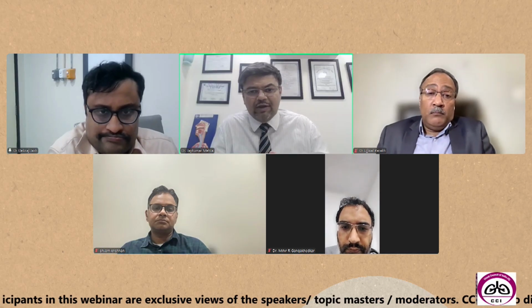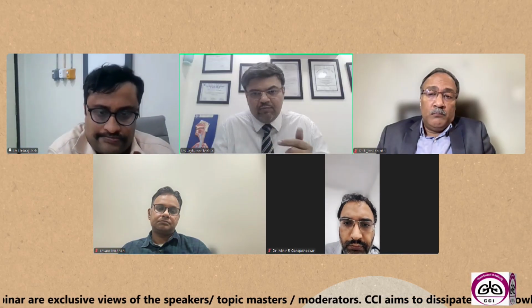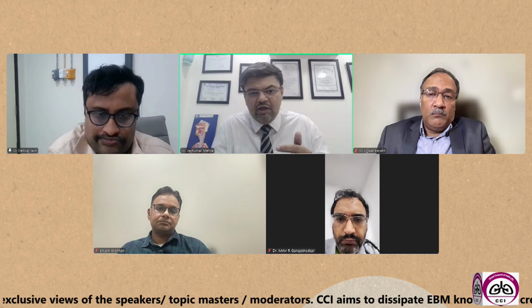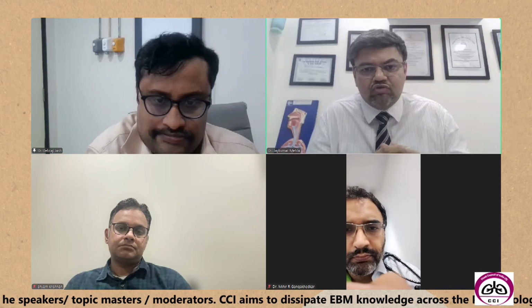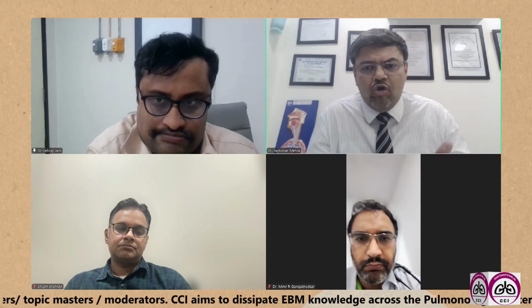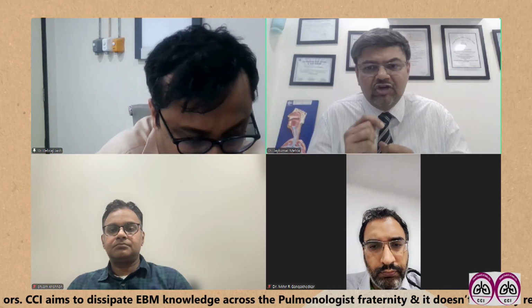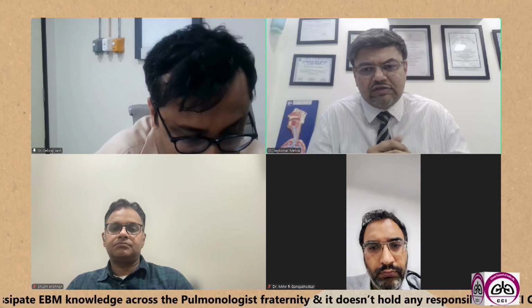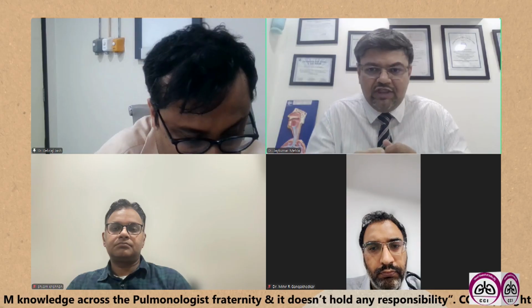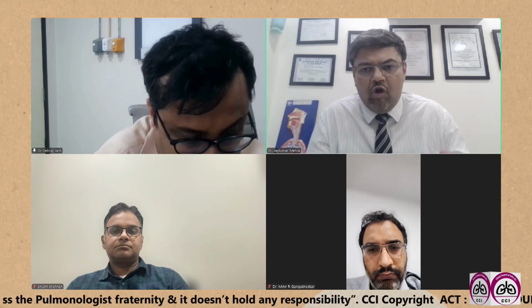if we are not able to get a good and enough specimen, and we don't have any other lymph node to be sampled, then we convert it into either EUS-B-FNA or EUS-FNA. I will share a recent experience where we didn't have a 19 gauge needle available, but our gastroenterology colleague had that 19 gauge needle. Because it's a big needle which passes through the EUS scope, we converted to that and then we got the yield. So it might not be feasible for all.